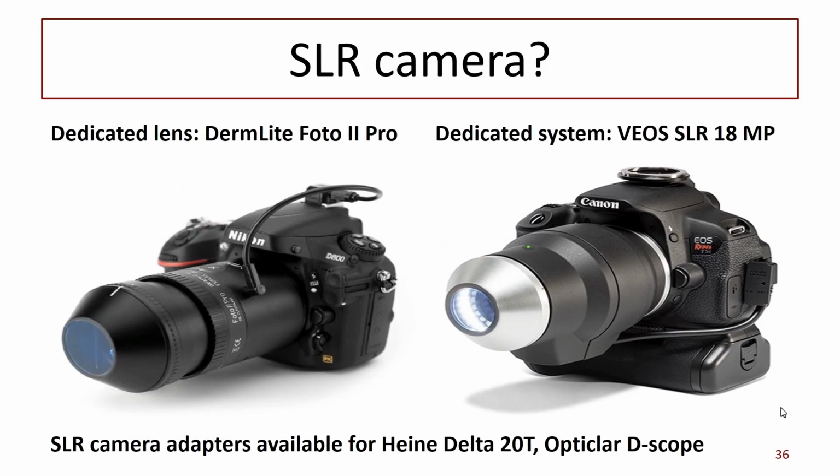So you could buy an SLR camera, but I counsel you against it. The SLR results are actually much less good than the others. But if you love photography, that's what you may choose to do. And the lenses are around $2,000 to $3,000 for a dermatoscopic lens. And it's really rather a shame that you spend all that money and actually you do better with the $20 one.